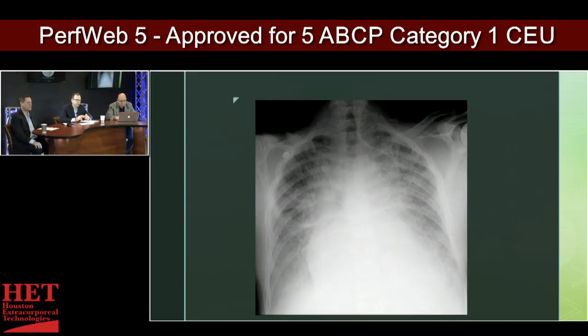And so, given enough time and sitting down and just kind of writing down your thoughts on a piece of paper, you'll come up with a diagnosis most of the time. And then obviously you put that in the context of the patient.